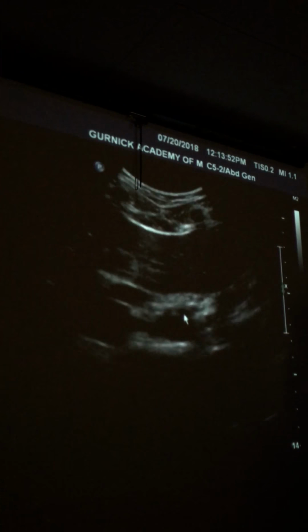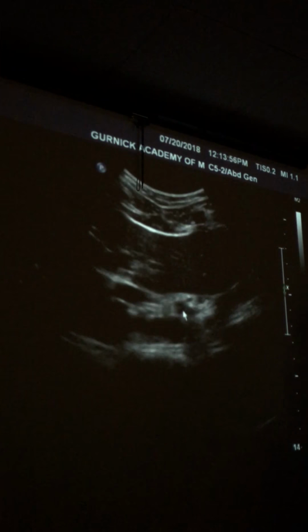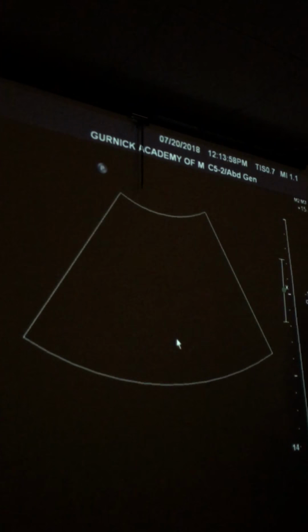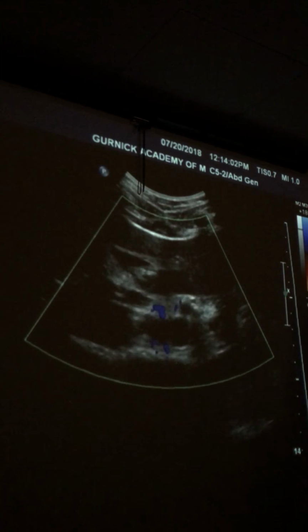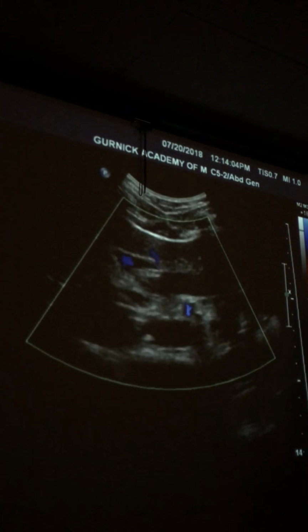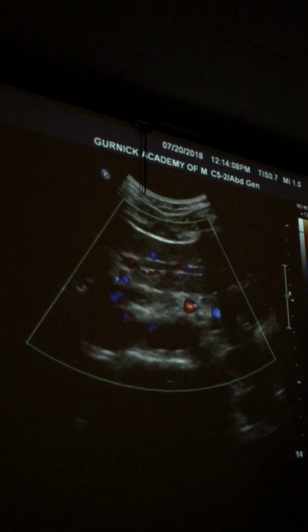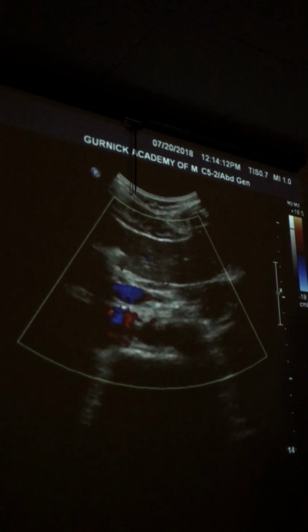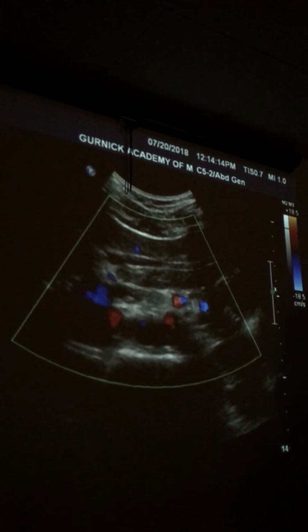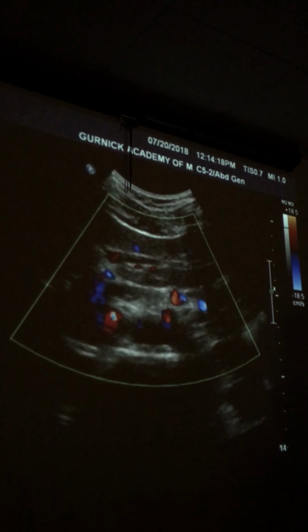So now I need to focus on where is her celiac trunk coming? Right there. Do you see that? Yeah. Color. How did it get inverted? So celiac trunk, so aorta, celiac trunk to my seagulls. And so Alan, see how it's blue? And that's okay, because it's going in the different direction.